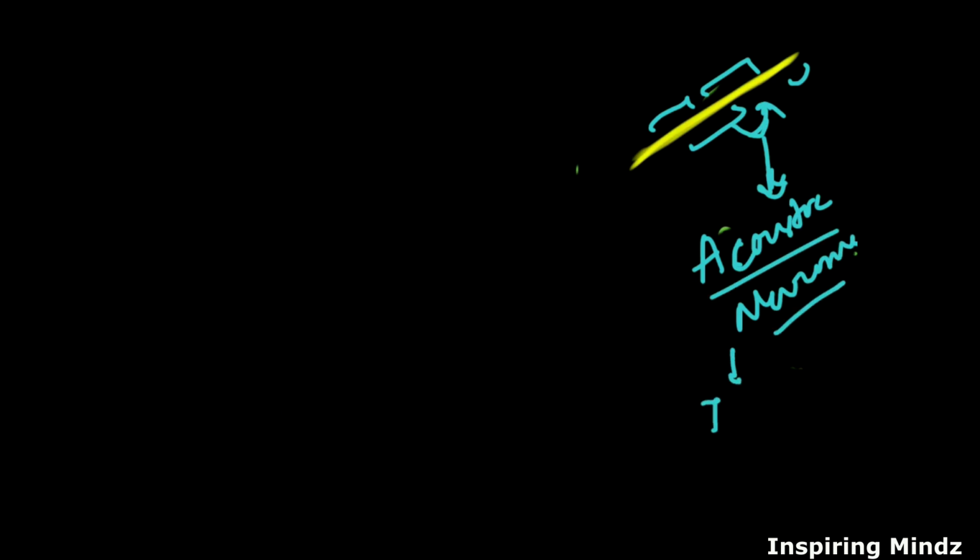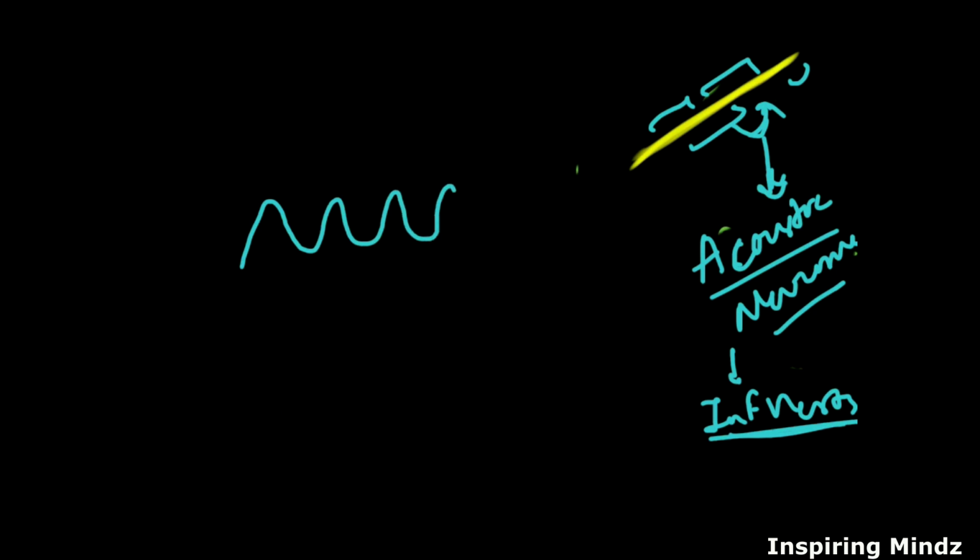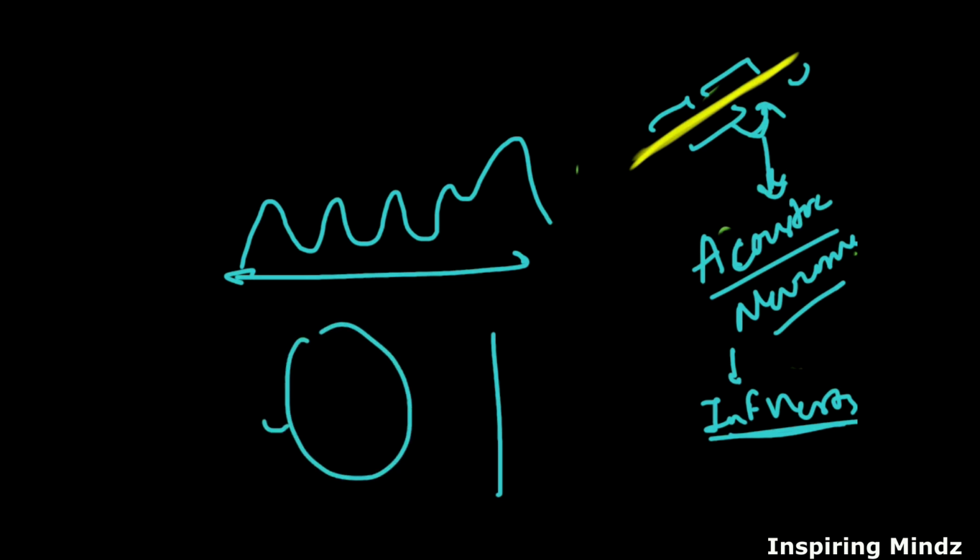The most common nerve involved is the inferior vestibular nerve. So there is pathology in the retrocochlear region, that means the waves will be delayed, especially wave 5. Suppose this is an individual who has a tumor in this inferior vestibular nerve and this nerve is absolutely normal.